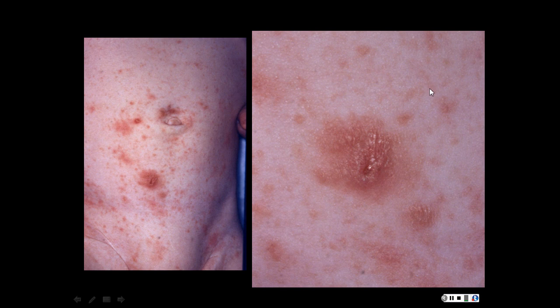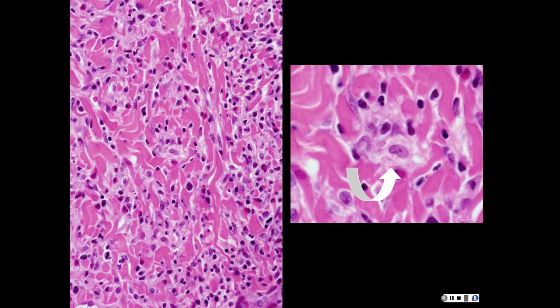Okay. And do you think they correspond to anything? I'm sure, like, hair follicles. Like follicles. And of the things you described, which one is more likely follicular? LCH. So the clinicians absolutely were thinking LCH, and so they biopsied thinking LCH. You've got reniform nuclei, you got eosinophils. They are all CD1a positive.